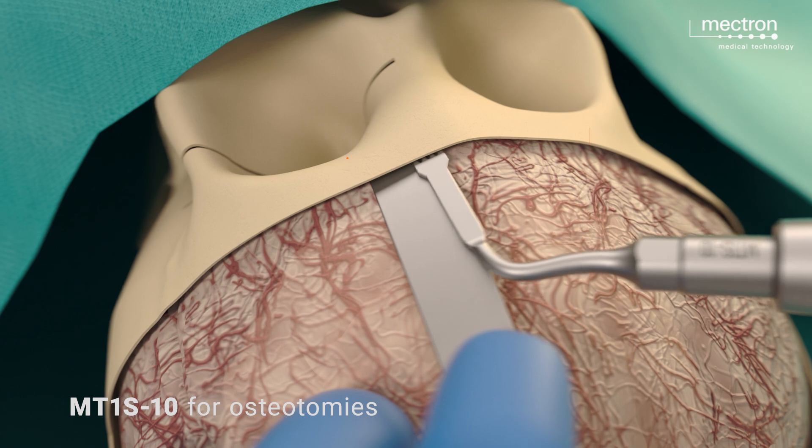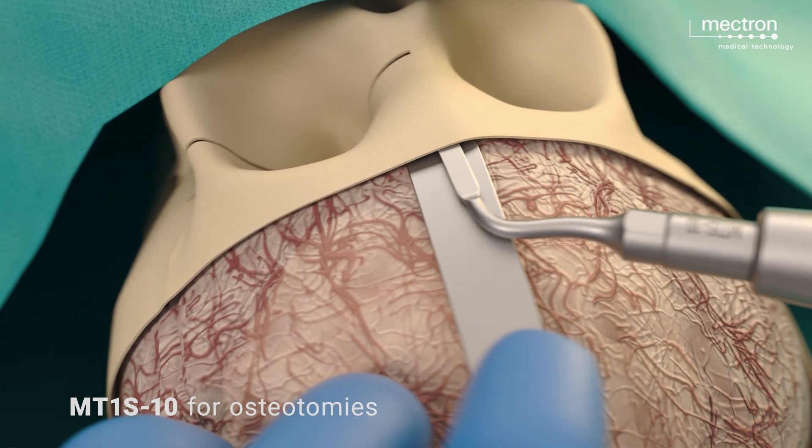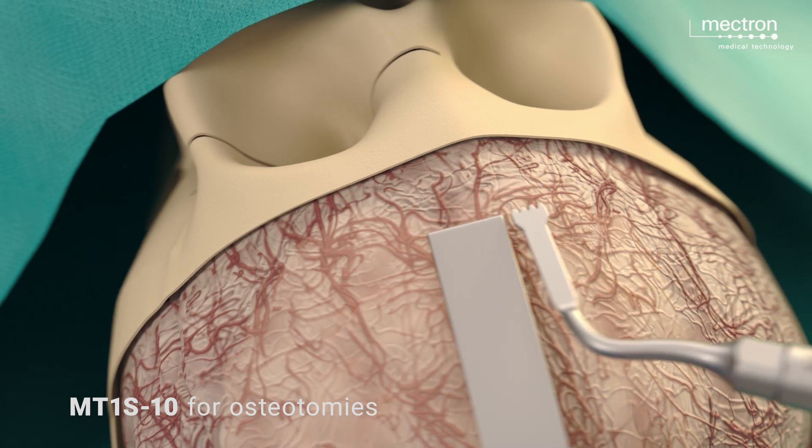With gentle retraction of the frontal lobes, the intracranial sides of the two orbital roofs are exposed and cut using piezo surgery, extending from the frontozygomatic junctions to the midline.